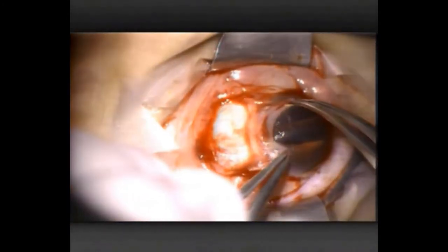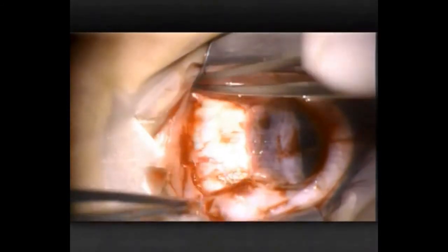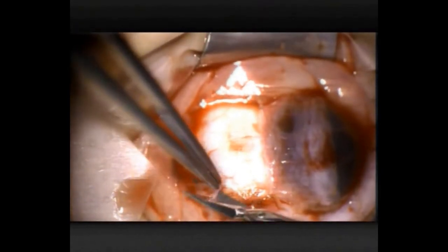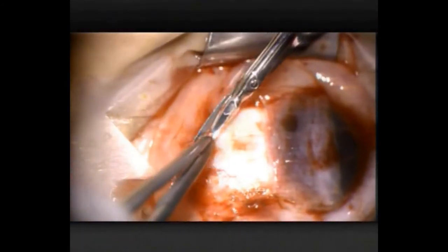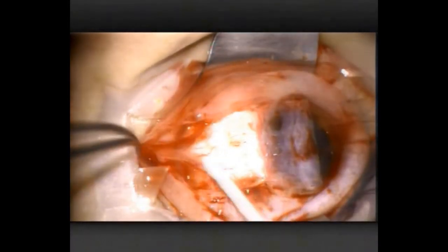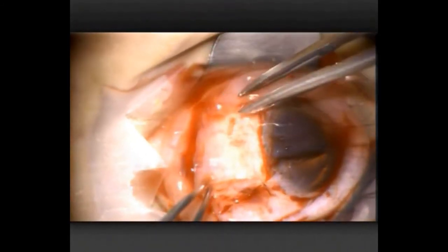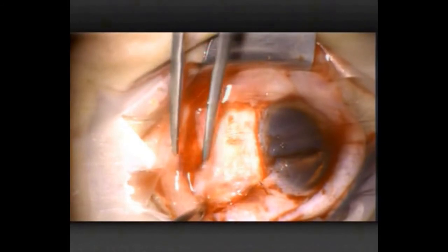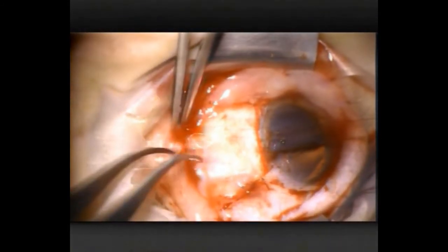Commonly with fibrin glue you'll get an accumulation of fluid post-operatively. You can see the nice little round hole that I've left in that graft. Again, stretching out the tissues — I'm conscious of trying to reform the plica semilunaris post-operatively. Some Tenon's is poking out there, so I'll just trim it off. Here's the fibrin glue going under the edges of the peripheral conjunctiva, and then I just reflect the graft back and oppose the edges so that they adhere. It actually sticks quite quickly — it's only a few seconds in each position that you need to compress them together.